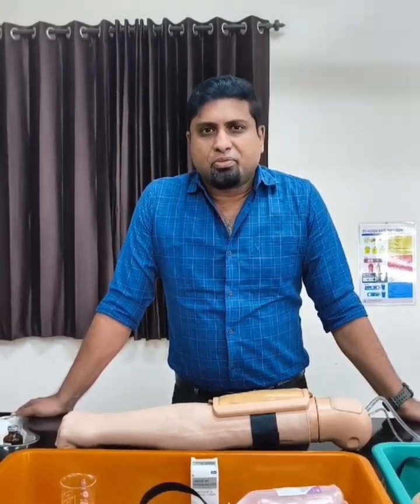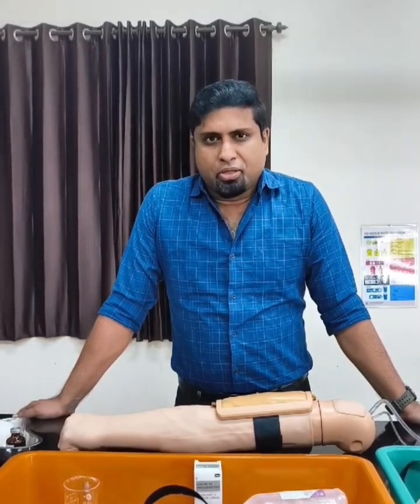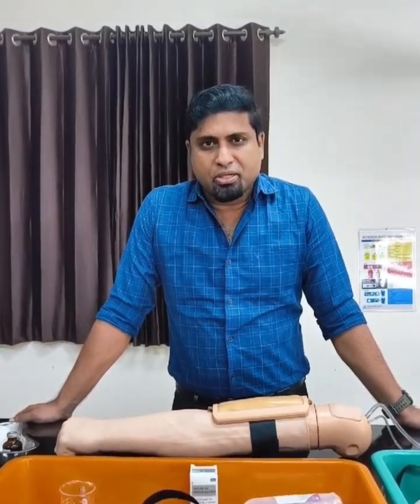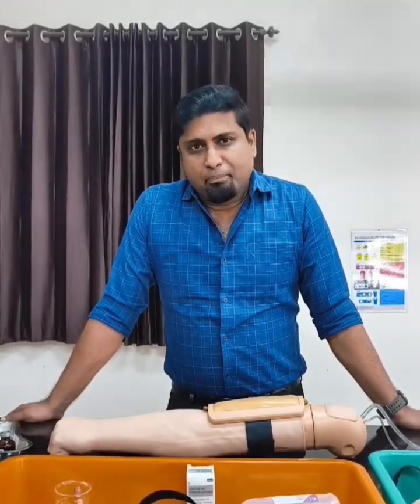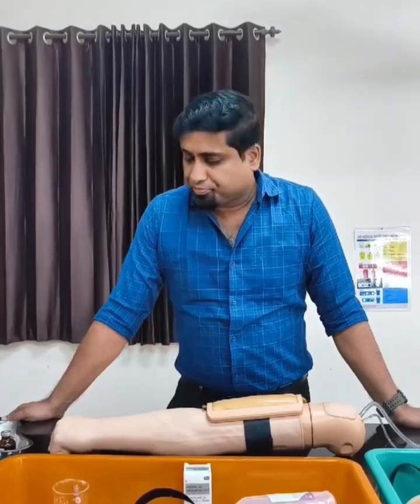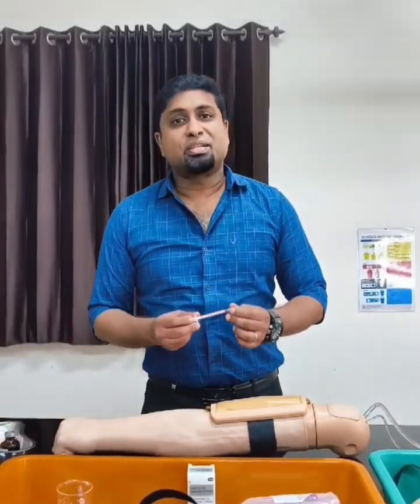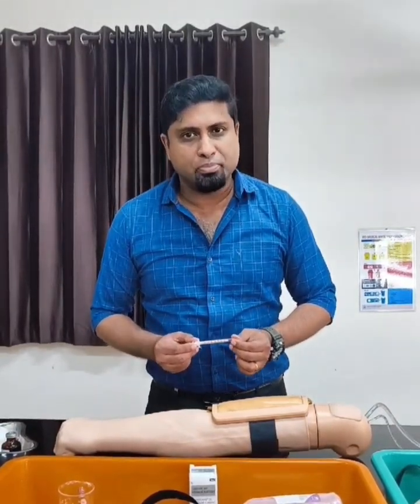Now, insulin may be available as U40 insulin. That means 1 ml of that particular formulation of insulin will contain 40 units of insulin. There are other preparations of insulin like U100 insulin, where 1 ml of that preparation will contain 100 units of insulin. So we need to be aware of different formulations of insulin that exist, because the kind of syringe that you will choose depends on the type of insulin that you are going to administer.